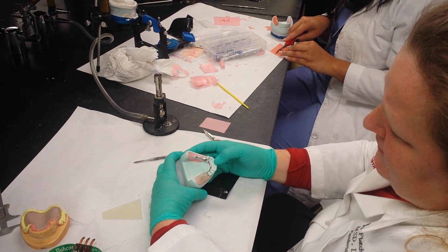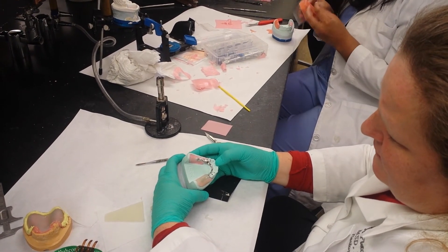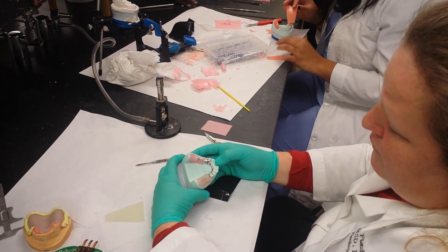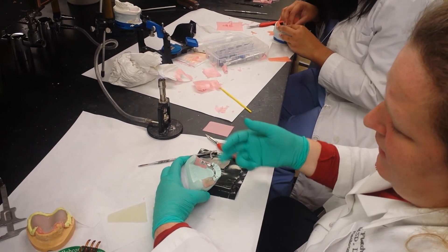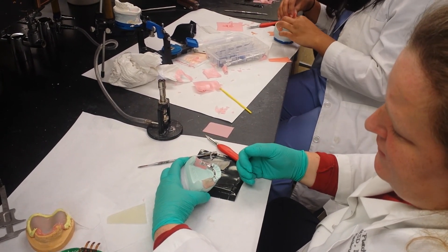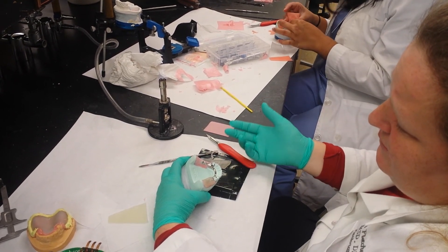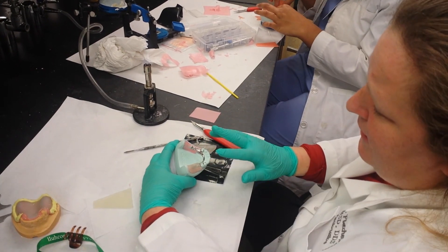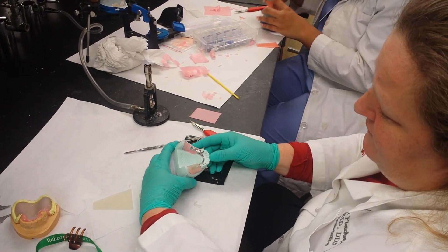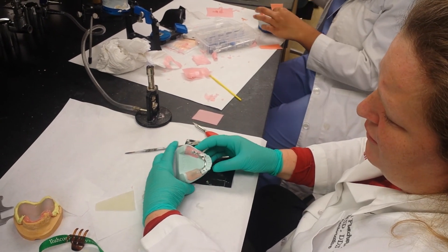After we've formed the custom trays, we're going to place them in the Triad light curing machine for three minutes, then take it off the cast, take all the block out wax out and clean it off, and then put it back with air barrier coat. Put it back in the machine for three minutes to finish curing. Try it back on the cast and make sure that it fits with two to three millimeters of room for border molding.